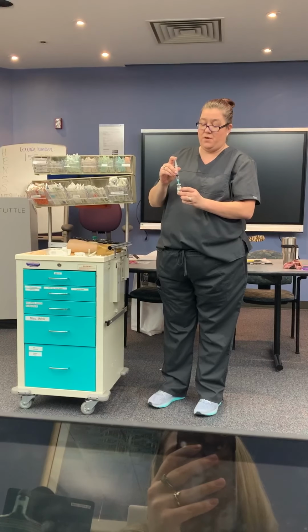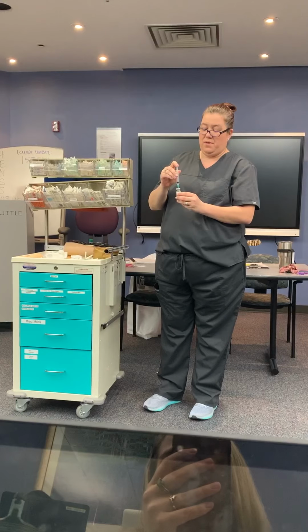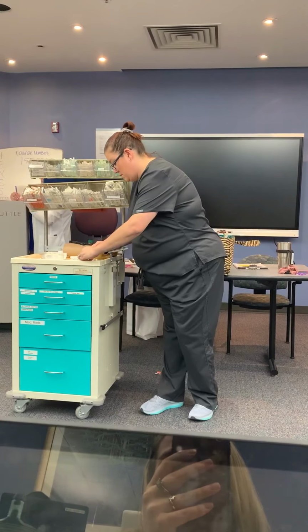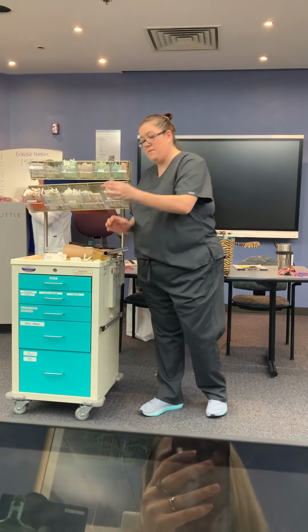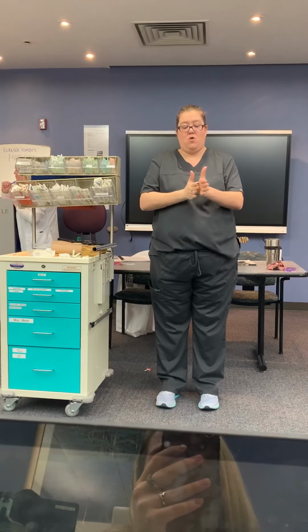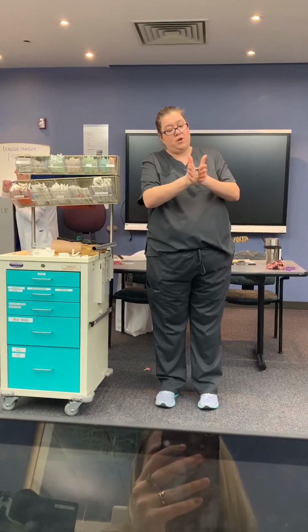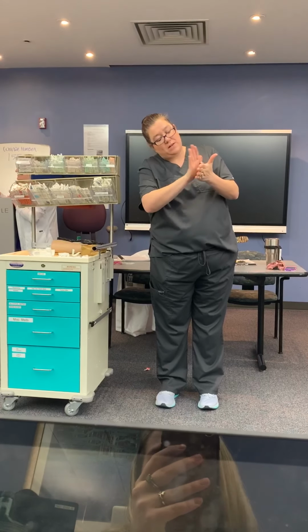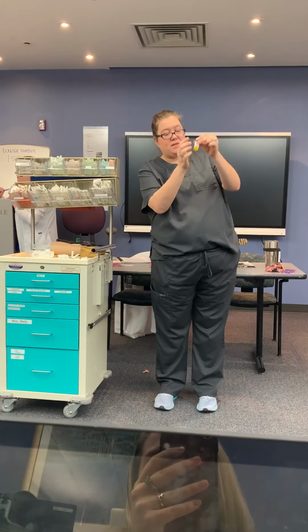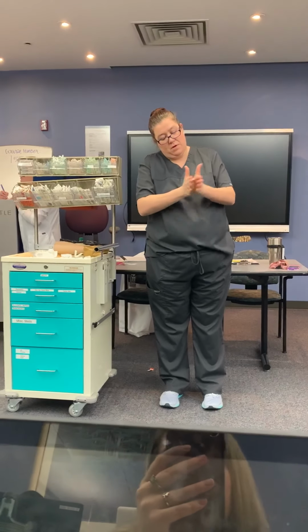Push this in slowly. If you go too fast, it will be very foamy. Okay. Here's the thing about these kind of medications too. Don't do this. Don't shake. You want to mix it, but you don't want to shake it. The more you shake it, the more violent the material becomes. So you don't want all of these little pieces of powder down there. You want to roll it in between your hands, okay?